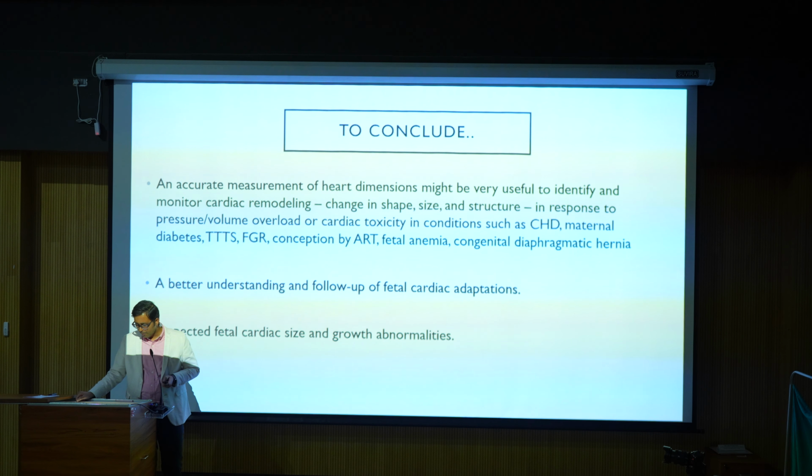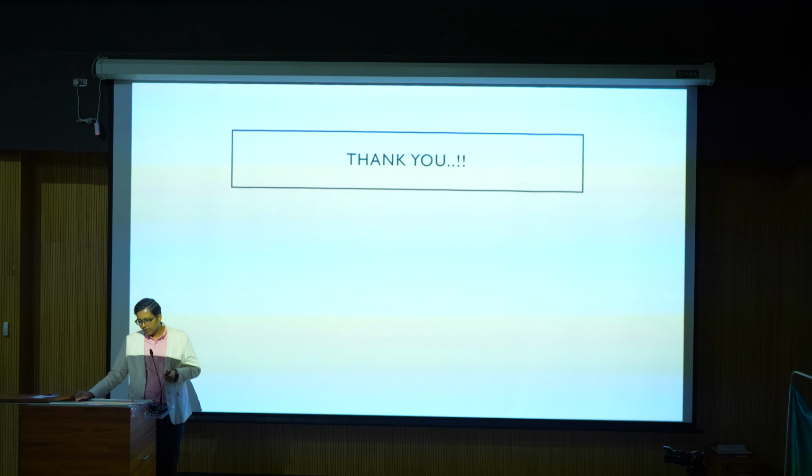So to conclude, an accurate measurement of fetal heart dimensions might be very useful to identify and monitor cardiac remodeling, change in the shape, size and structure in response to pressure and volume overload or cardiac toxicity in conditions such as congenital heart diseases, maternal diabetes, TTTS, FGRs, etc. It gives us a better understanding and a follow-up of fetal cardiac adaptations over a period of time, and in suspected fetal cardiac size and growth abnormalities also, it is very important.